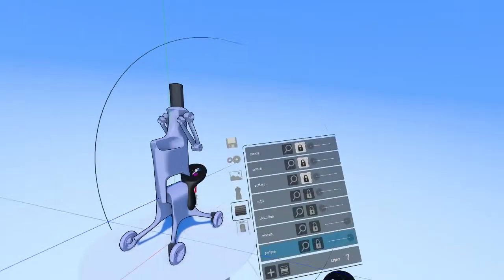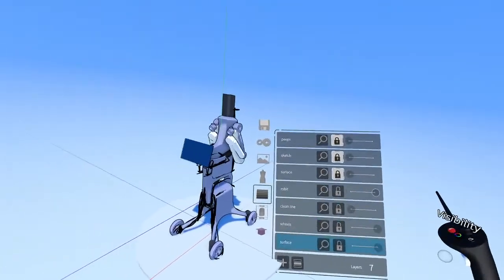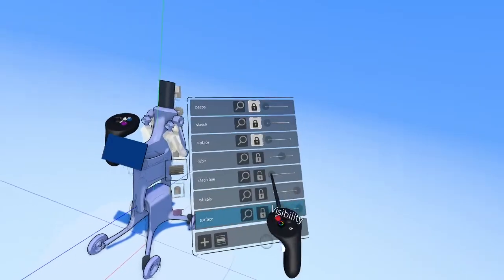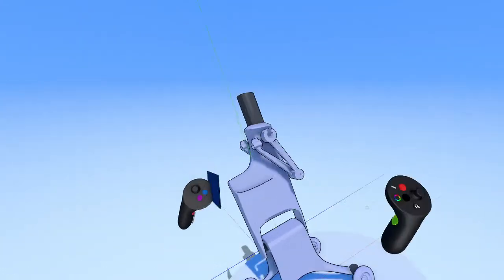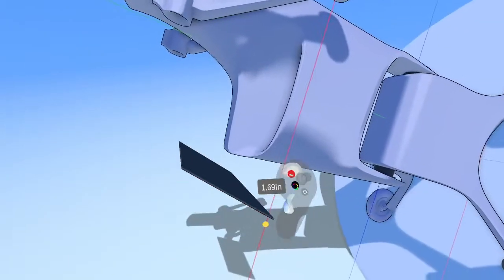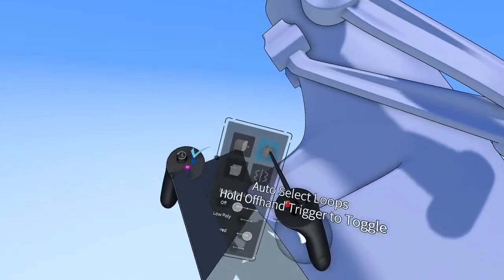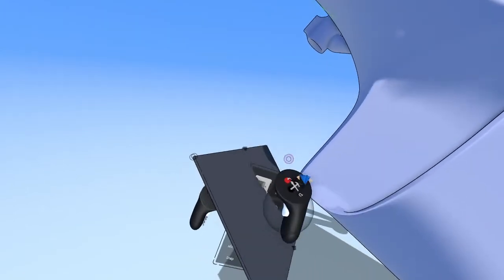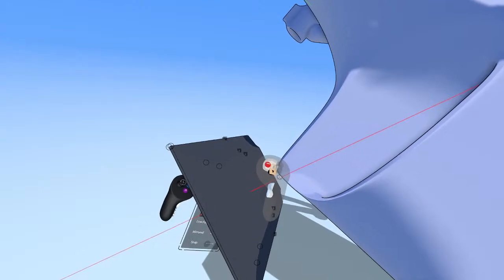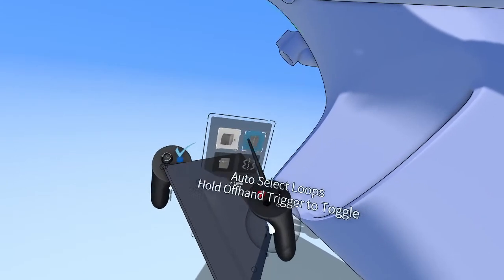Okay, and last thing I want to do, just because I really like the idea of the screen here, is actually just grab the screen, drop it on the surface layer, drop down my sketch here, change this to be a dark color, and because it's sub D already, we can work with the surfaces we already have, like this.